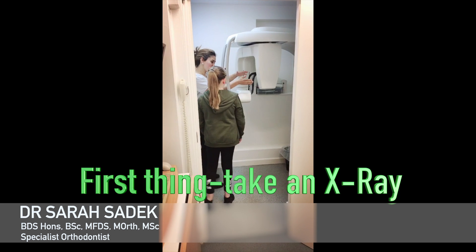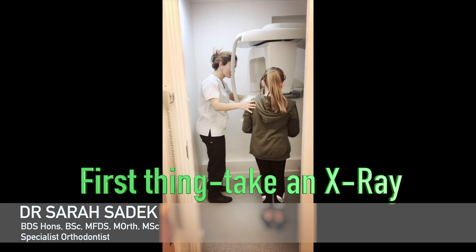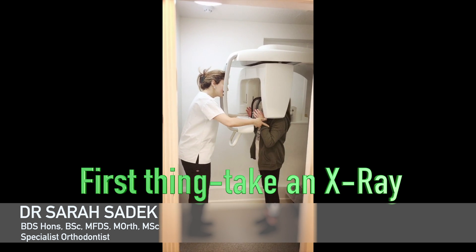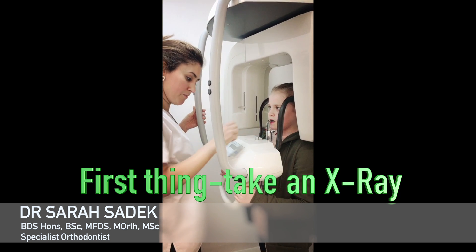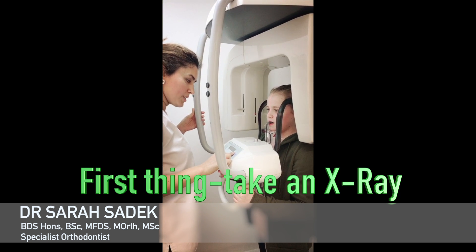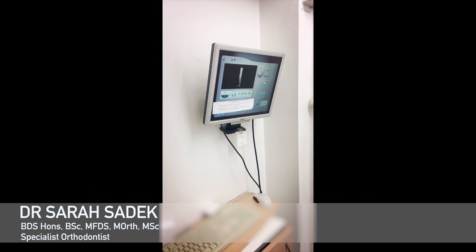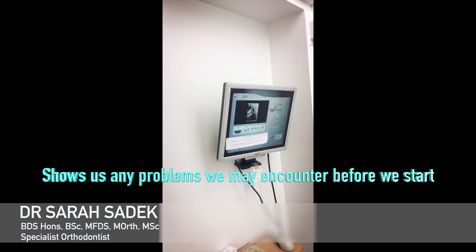One of the first things you will have done at your brace fitting appointment is have an x-ray of your teeth. This allows us to have a look at any abnormalities. In particular, we will be looking at the length of the roots of your teeth. We'll be checking the supporting bone structure to make sure it's healthy, and we'll have a look to see if there are any missing teeth or perhaps even extra teeth.